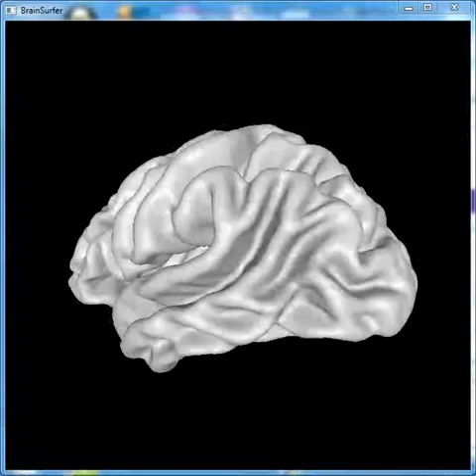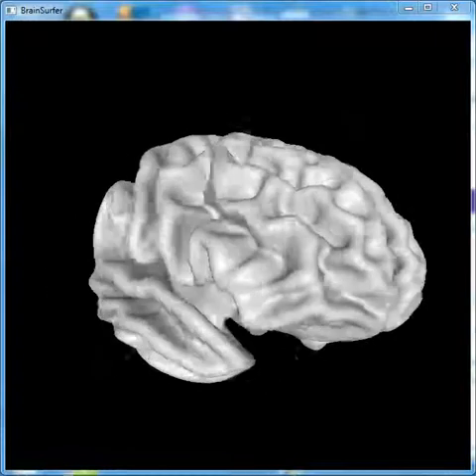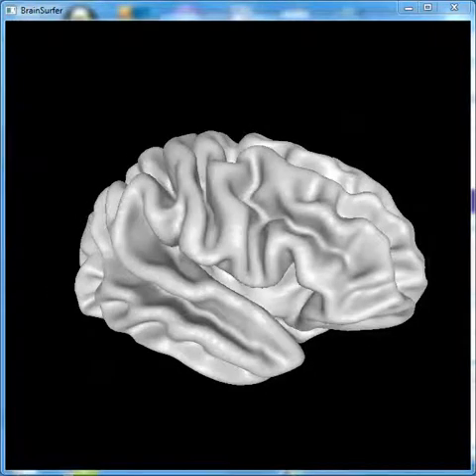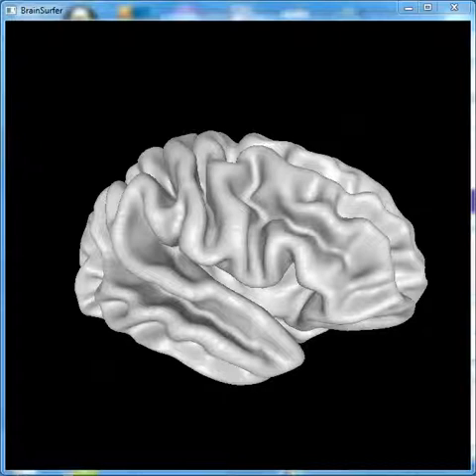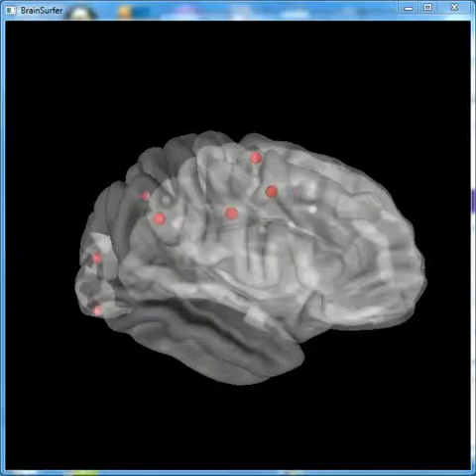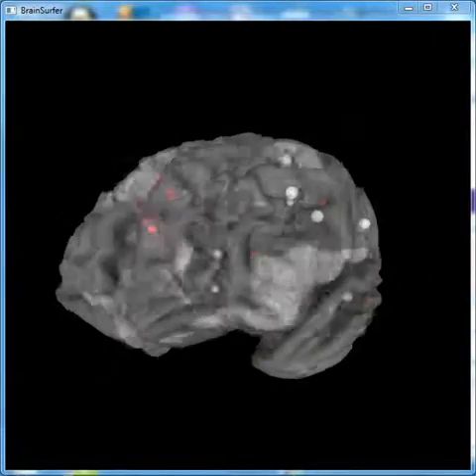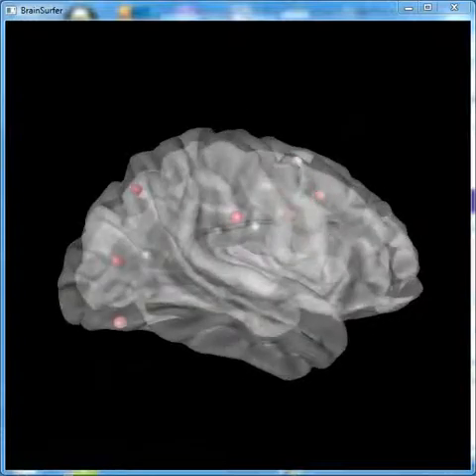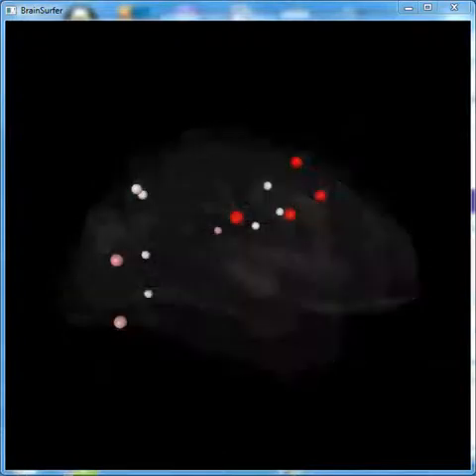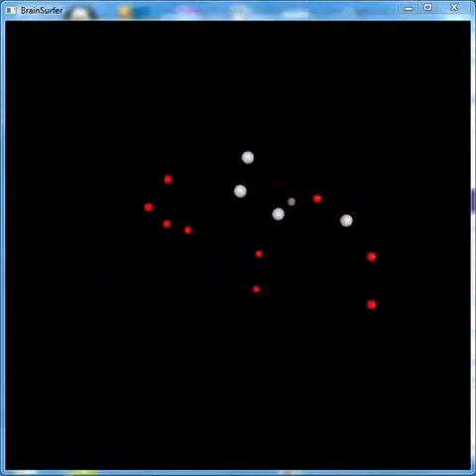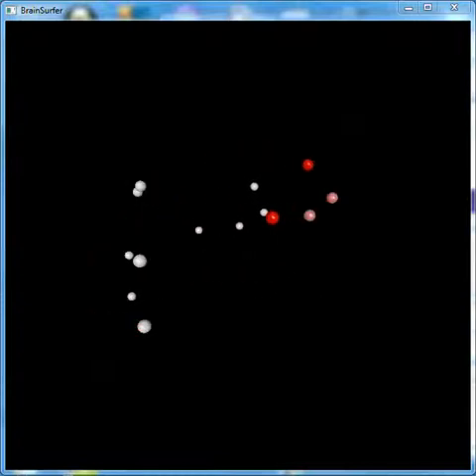At this moment, I've activated the dorsal attention network of the Brodmann area nodes. In order to view them, we'll make the brain more transparent. These are real-time Z-scores of the nodes that comprise the dorsal attention network. This can be used for biofeedback, in which the patient is instructed to make these spheres — which are Brodmann areas — reach the white state, which would be the state of maximum stability of the attention network.